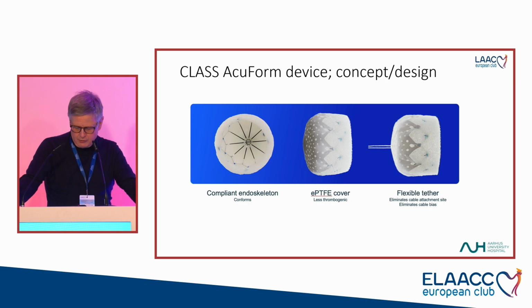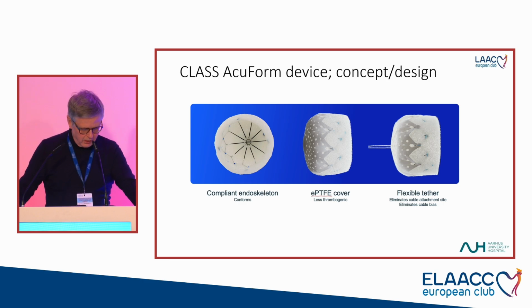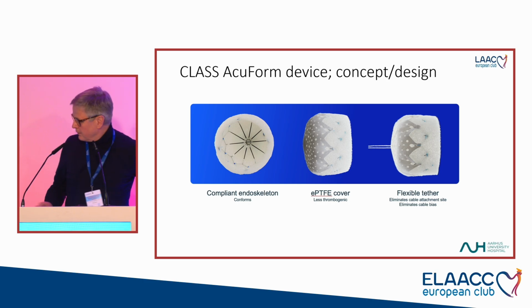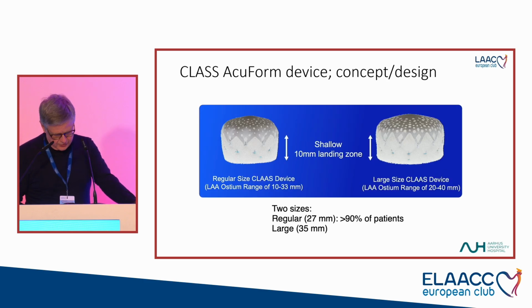So the way that you are in attachment with this device is by means of a suture or a tether that you can see on the right-hand side. And if you look at the device from below on the left-hand picture, you can see the central part. There is a pin, and I cannot mark here, so, okay, there is a central pin, and that's where the tether is attached.